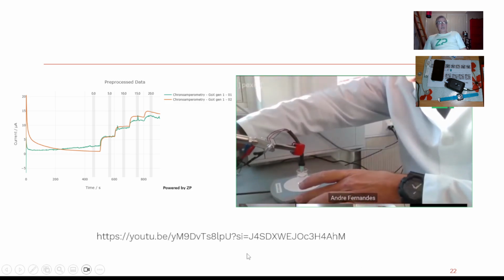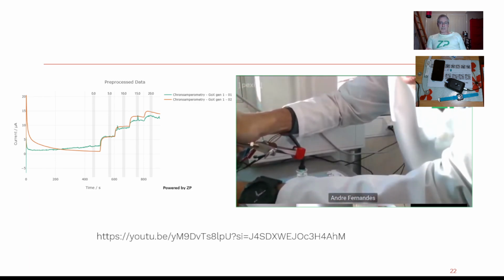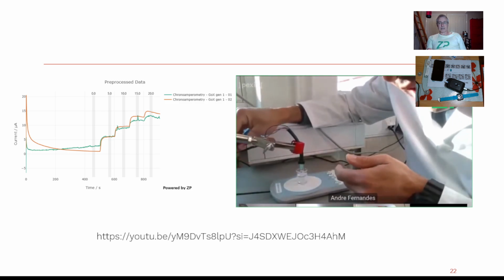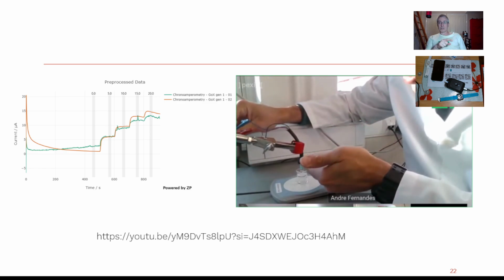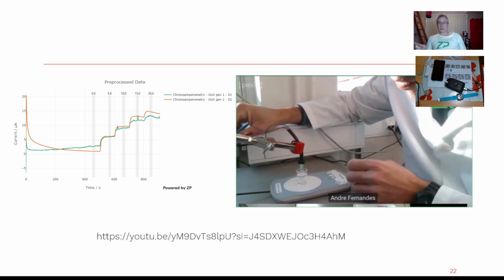So your microneedles have come from a third party. Your currents are exceptionally high. If your currents are that high, I'm going to talk about oxygen limitation in a little bit, but I actually think you've got a corrosion problem. You can see your currents versus our currents, and it's not just about surface area there. You've got something else going on.